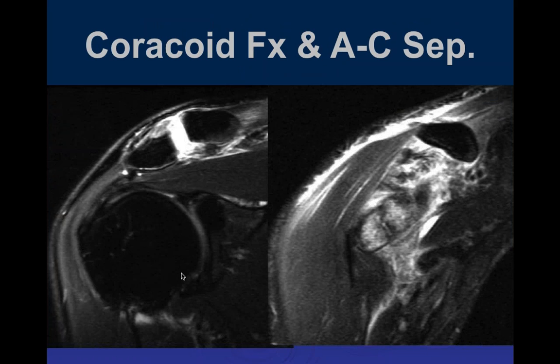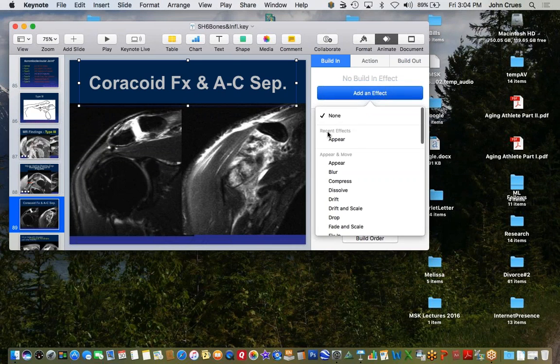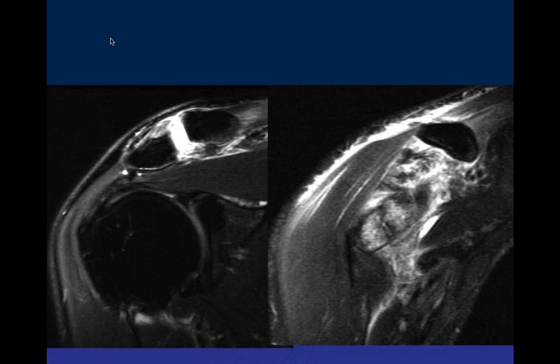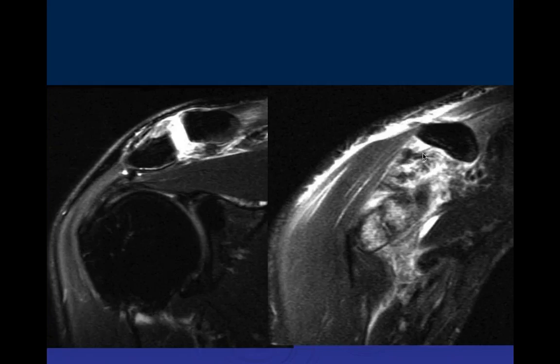On two coronal PD fat-sat images, there's extensive edema at the level of the distal clavicle, widening, and edema extending beyond the capsule. On the more anterior image, there's an ossific body just beneath the skin surface with extensive surrounding edema. This represents a coracoid fracture with AC separation.